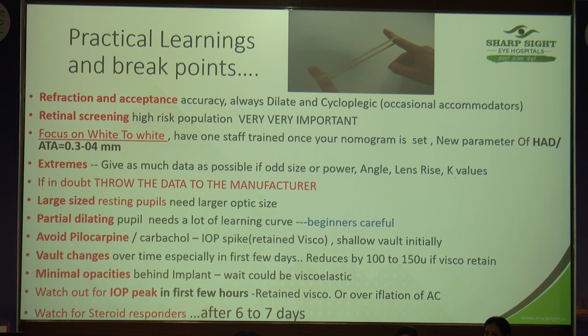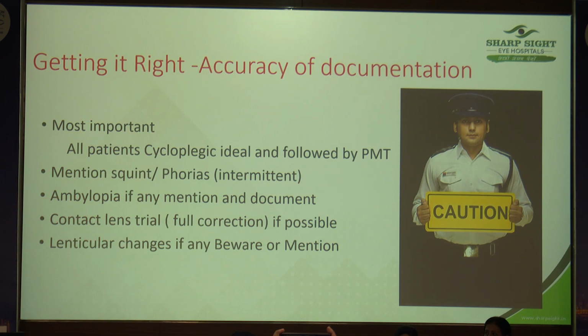As I must mention, pupil size is very important. It is not stressed by a lot of people who are doing phakic lenses. From my long track record, I've realized pupil size plays a huge role in your patient satisfaction.